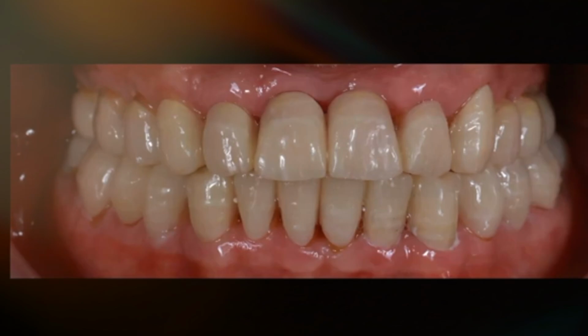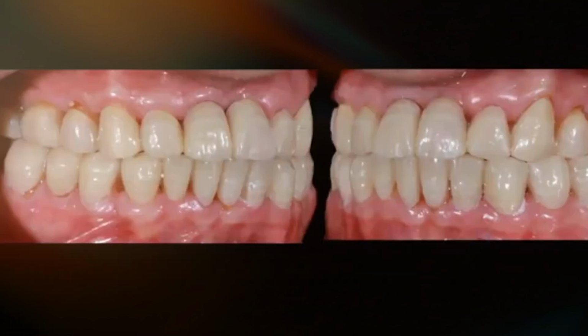Just we get over this like a shell. And we didn't care about being supra or subgingival or whatever. The only thing was to verify the phonetics, aesthetics, color, and position of the teeth. So we get some photos, some information from these PMMA provisionals.